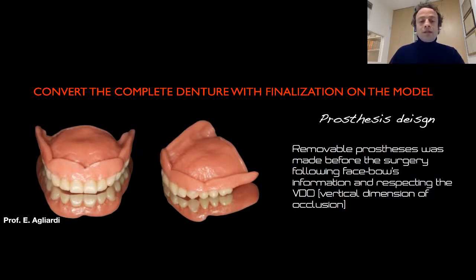The patient has to stay 3 months with this prosthesis that can have from 8 to 10 teeth. That's it. Then when we prepare the long-term temporary restoration, we can create distal cantilevers because the prosthesis will be metal reinforced, and in that way we can deliver a prosthesis with 12 teeth.